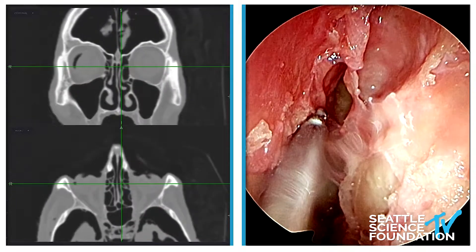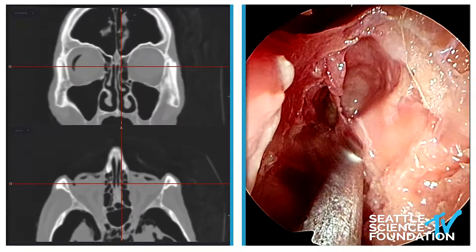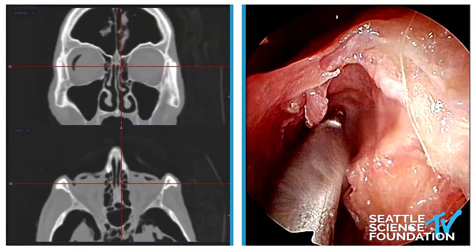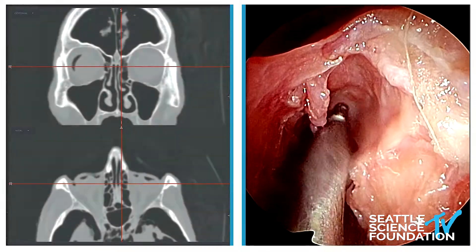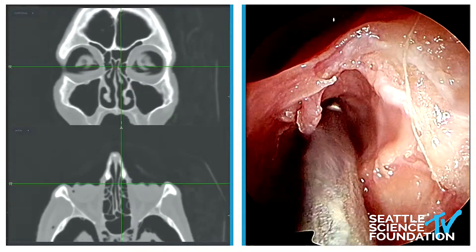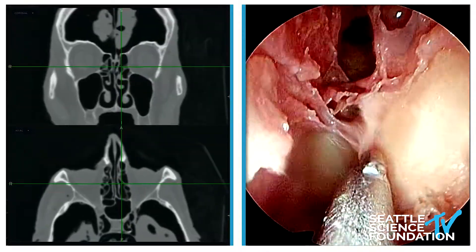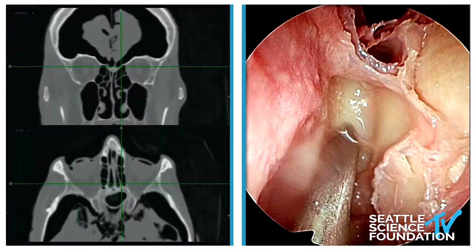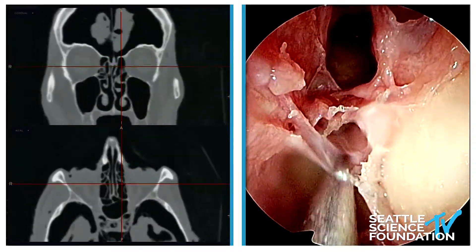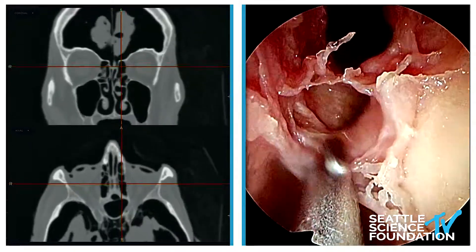There's middle turbinate and that plane between the bulla, which Winston nicely came over and took the bulla almost to orbit. The orbit itself — you can see the orbit in the whole plane. The anterior wall that I colored blue in the dissection — there's the backside of the beak and the cellularity of the agger that'll be here. And so what I want to show you is that the artery is something if we want to find — find the four walls of this dissection — I'm going to show them to you again and piece together that anatomy.